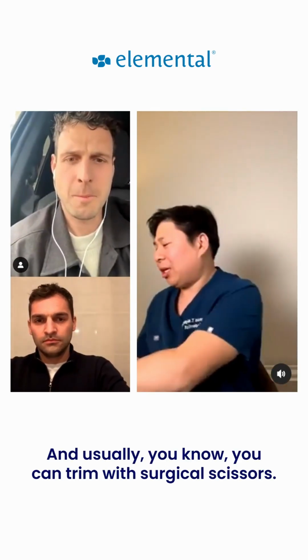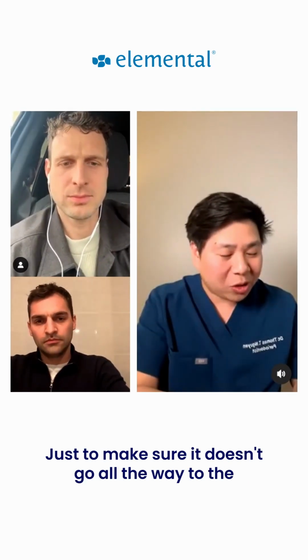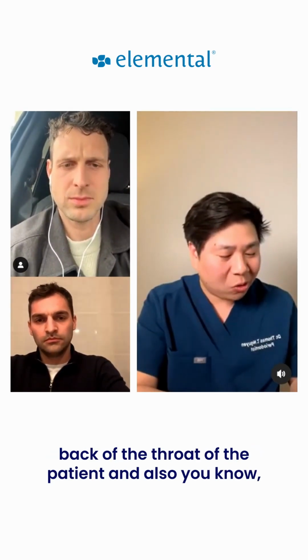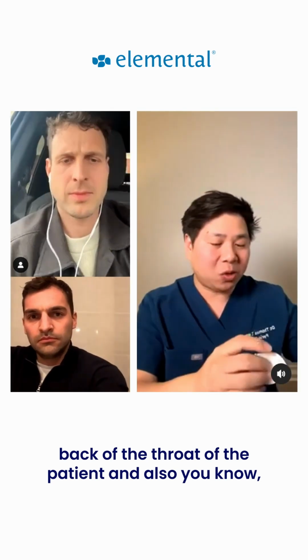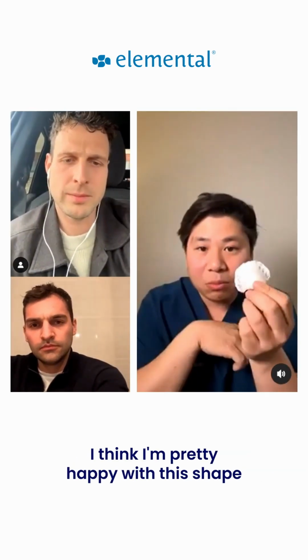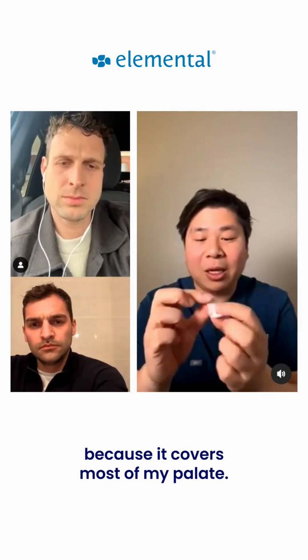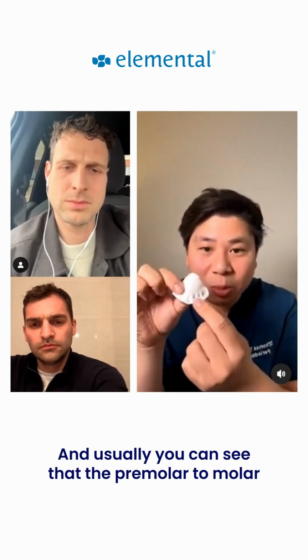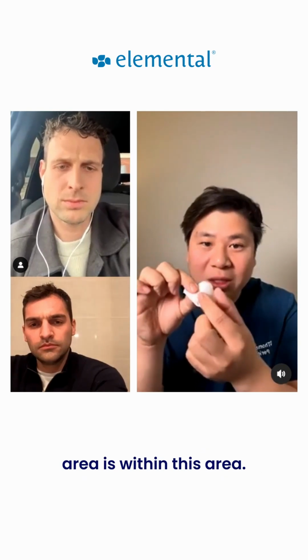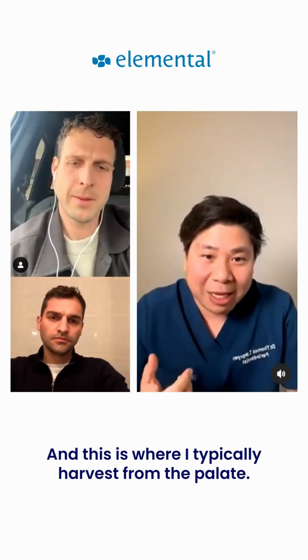And usually, you can trim with surgical scissors just to make sure it doesn't go all the way to the back of the throat of the patient. And also, it's not too bulky for the patient. I think I'm pretty happy with this shape because it covers most of my palate. And usually you can see that the premolar to molar area is within this area. And this is where I typically harvest from the palate.